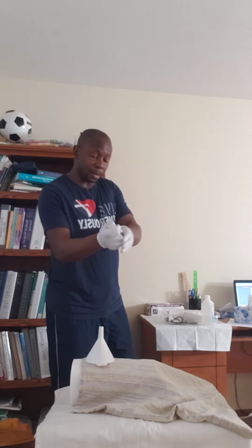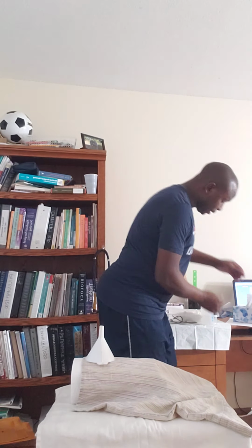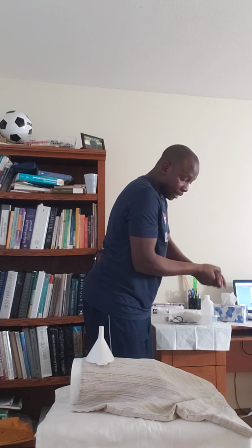Now if I'm done cleaning those things, I'm going to remove my gloves and wash my hands. Now I'm getting another sterile kit, and then I'm repositioning the client.